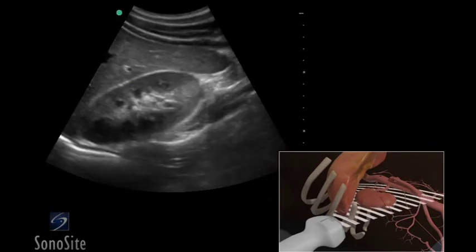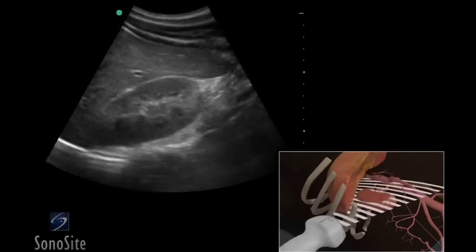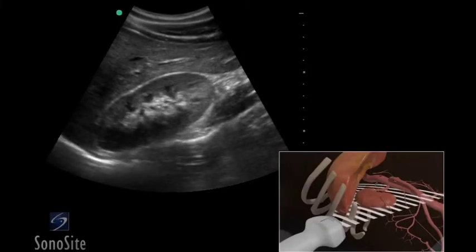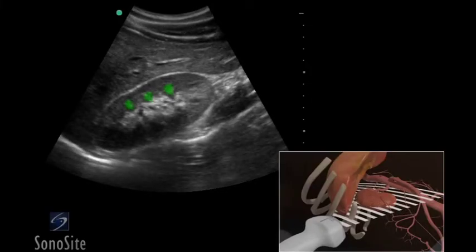The transducer is swept from anterior to posterior to image the kidney parenchyma, which will appear hypoechoic when compared to the liver. The renal pyramids are triangular in shape and darker than the renal cortex. The renal pelvis will appear as bright hyperechoic echoes within the kidney.